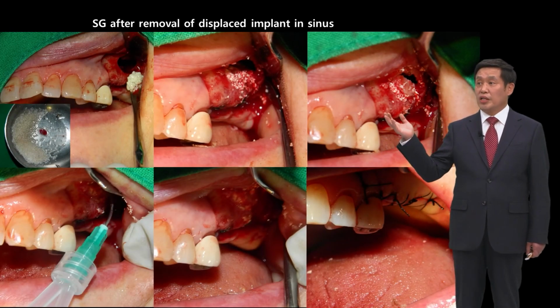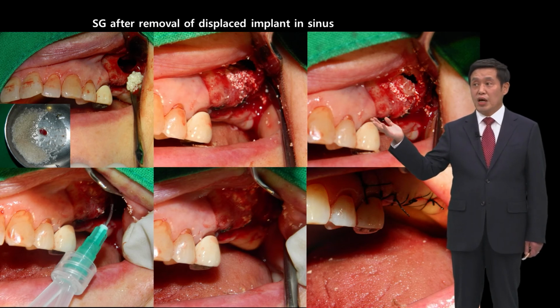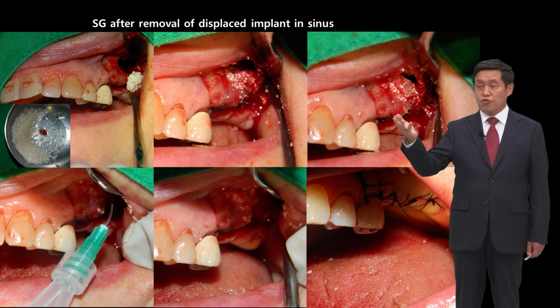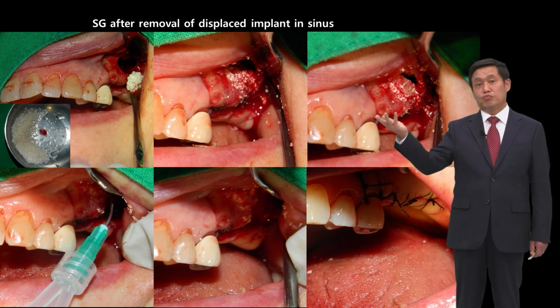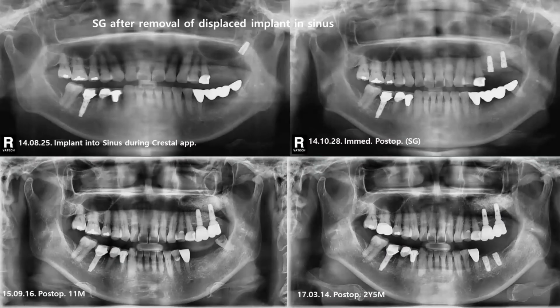Big laceration occurred. Following the traditional method, xenograft and allogenic bone graft was used for bone graft. On top of graft material as shown on the model, fibrin glue is used. This is used to fixate the graft material.